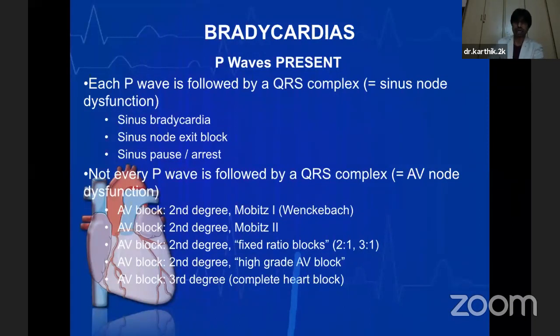In second degree heart block, we have sometimes certain entities called 2:1 heart block or 3:1 heart blocks, where you can see that after every second beat or third beat, a beat is completely dropped or missed. A P wave is not followed by a QRS complex. So that also comes under the class of second degree heart block. The PR interval is very high, and at random, you have the QRS complex missing.